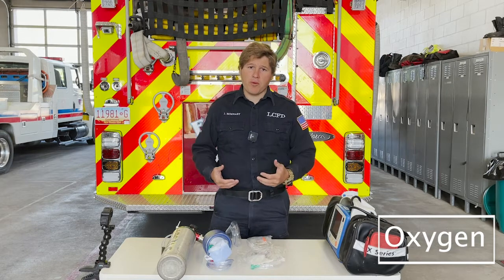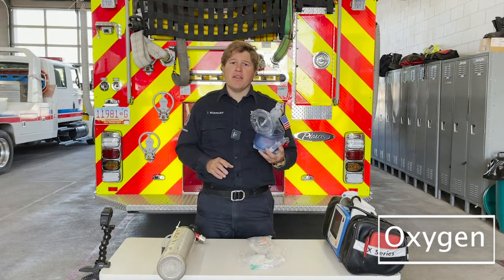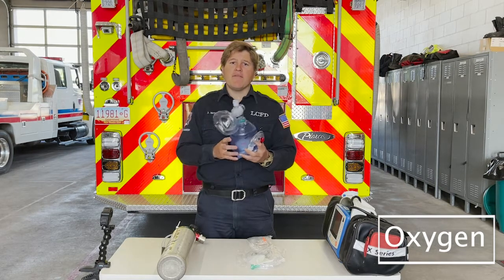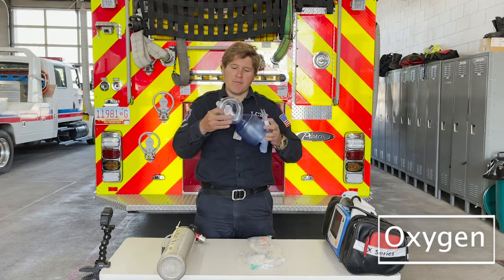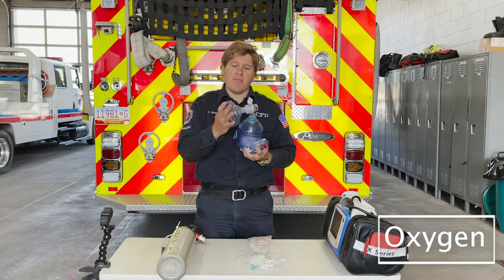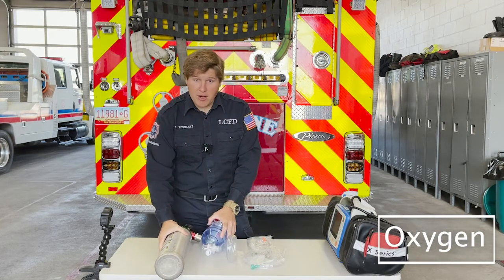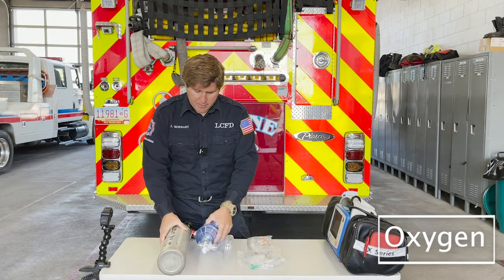When the code progresses, we want to pull out our BVM, of course. Have this ready. Even before we try to attempt, there's no point to have this in the bag if we don't have this ready. Make sure the actual valve mask is on. Make sure it works. Have your oxygen ready, whether it's on your non-rebreather or your BVM.